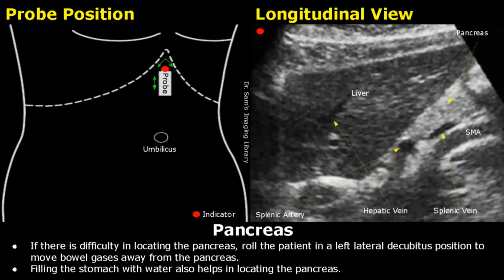You can also ask the patient to drink some water to fill the stomach. This water-filled stomach makes it easier to scan the pancreas as the stomach gases are removed.